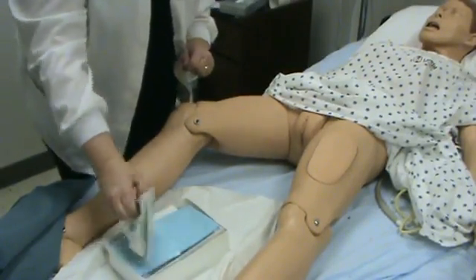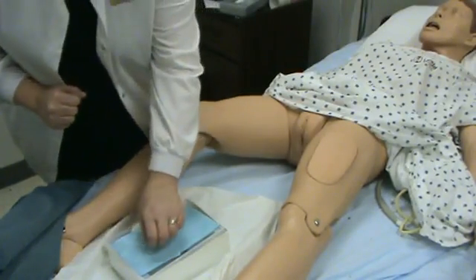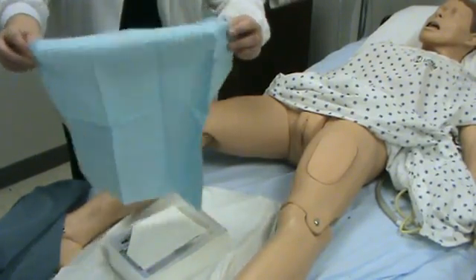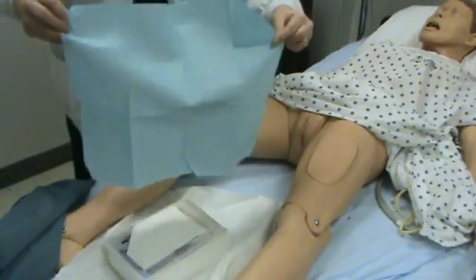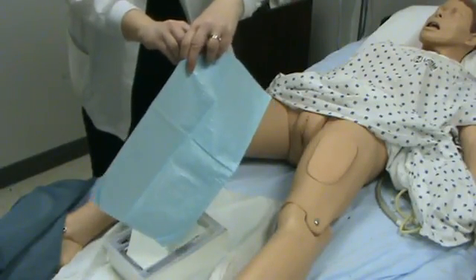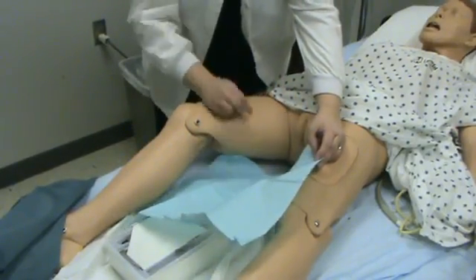Here are your latex gloves. We are going to take those and lay them here on the table. Here is your sterile drape. You grab it from the shiny side — grab the two corners and shake it apart. What I like students to do is fold the inside so that the shiny side is out.